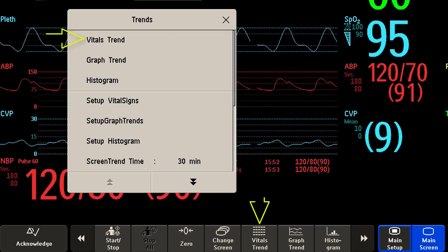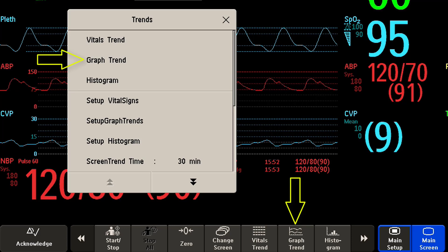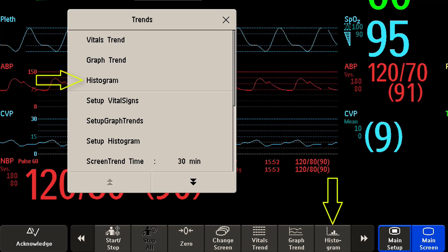There is a smart key to view a tabular trend called vitals trend, a smart key to display a graphical trend called graph trend, and there may also be a smart key to view histogram trends.